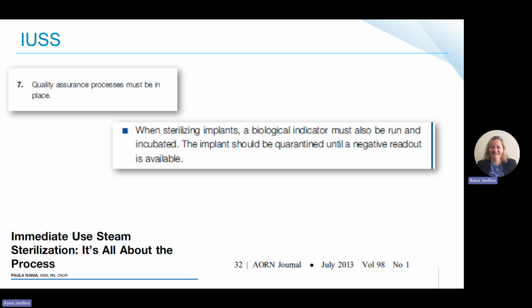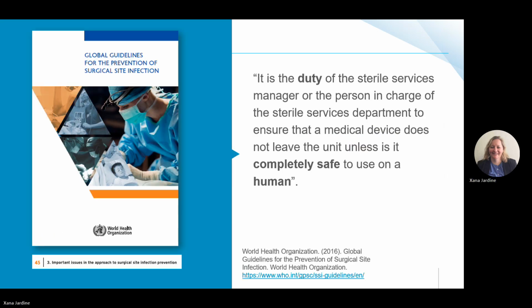I suppose it depends on the type of BI used, and it depends on the length of the procedure that you're doing. But at least doing a BI is something that is very, very important. And maybe you want to consider doing a BI on a daily basis if you're using your flash very often.